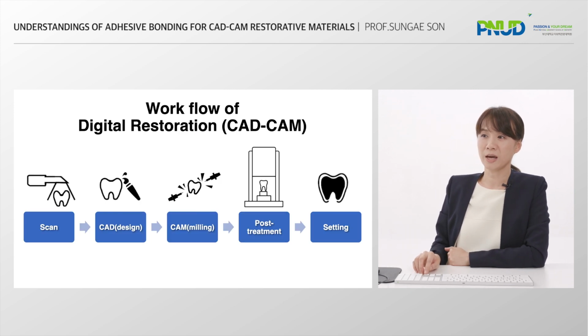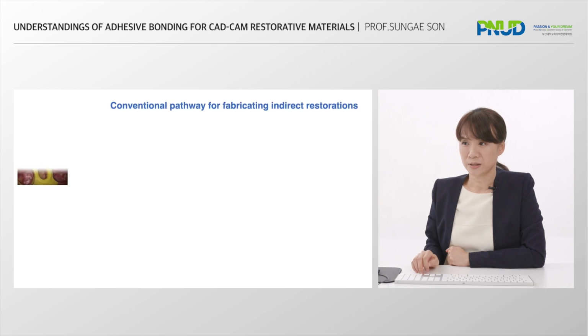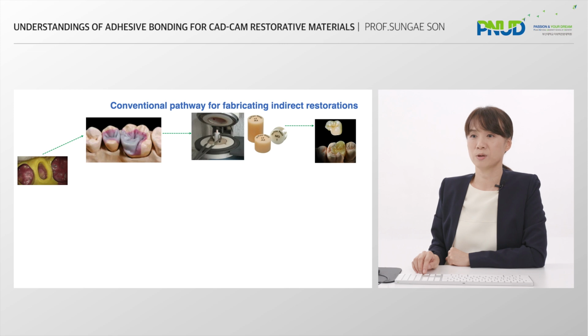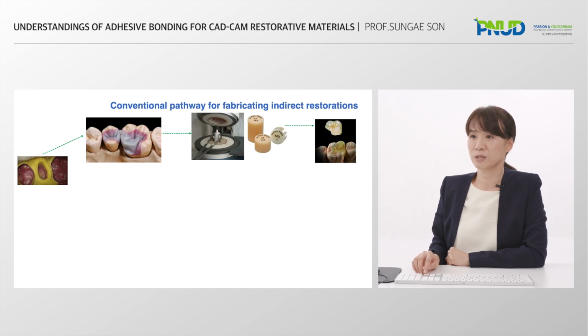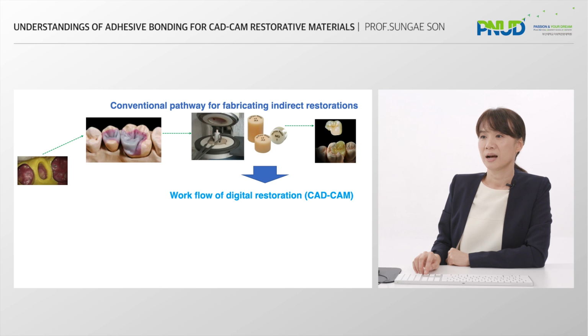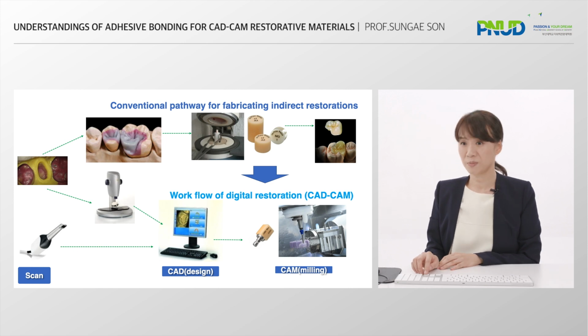Presently, the use of CAD-CAM restoration has increased due to its ease of use and speed of recovery. Indirect restorations can be manufactured in various methods. The conventional pathway for fabricating restorations has many steps, including procedural errors. However, digital workflow provides accuracy of restorations as well as convenience.